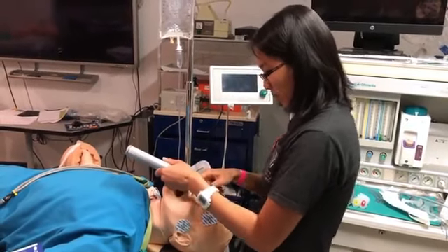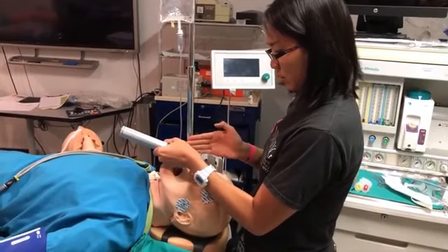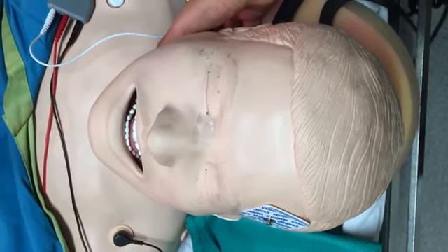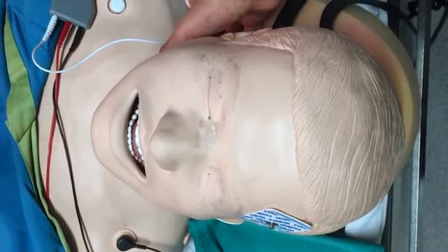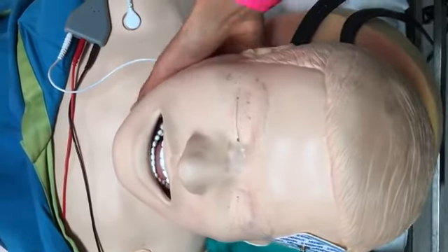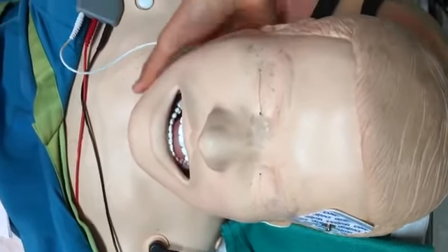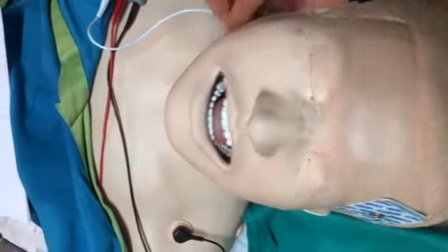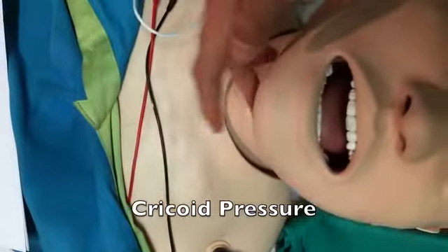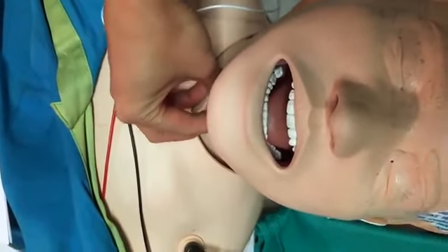So when you're in the correct place, you want to go up and forward. And then when you see the vocal cords, that's when we get ready to intubate. There are external measures you can use to help when you intubate someone for a better view of the vocal cords. With your right hand you can help extend the neck even more, place it right here, or you can put cricoid pressure, push down, and that helps bring this into a better view when you're doing direct laryngoscopy.